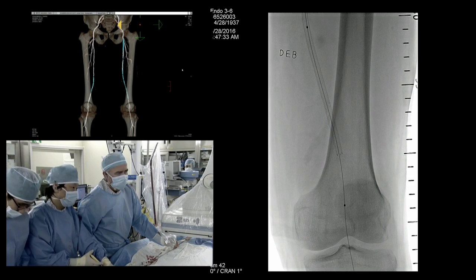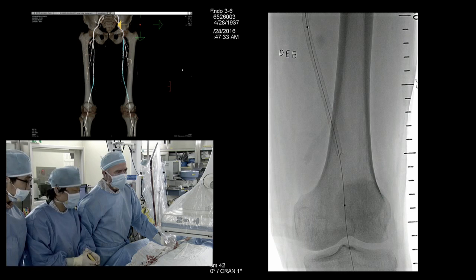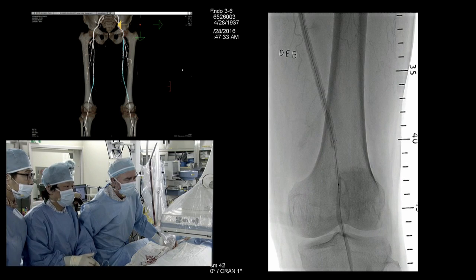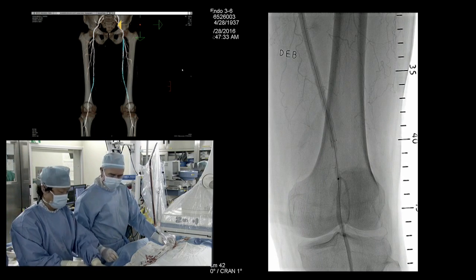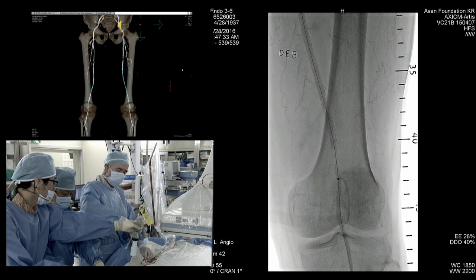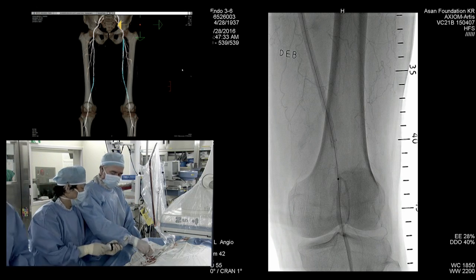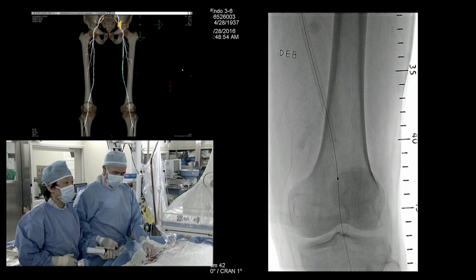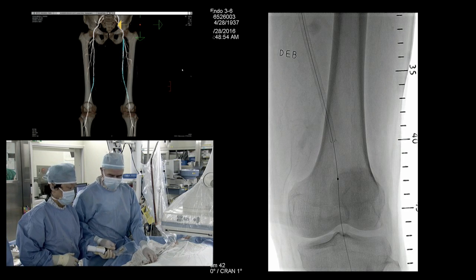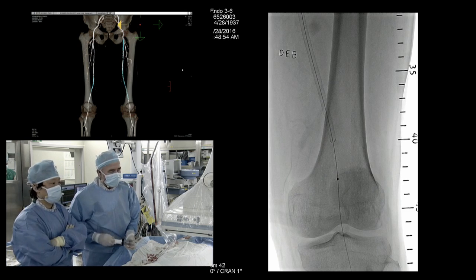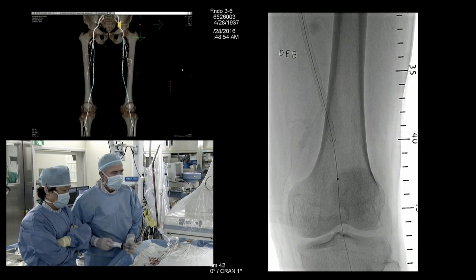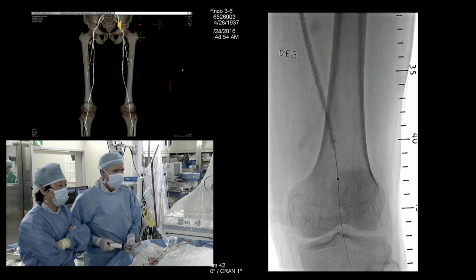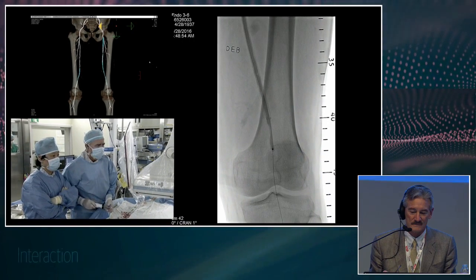I want to start right there. Let's go ahead and go up. I like to do three-minute inflations with these DCBs. Remember that area was not pre-dilated, so I would go up nice and slow. We're not going to go too high — we'll see how it looks as it goes up. It's a 5-millimeter diameter, 150-millimeter length IN.PACT Admiral.